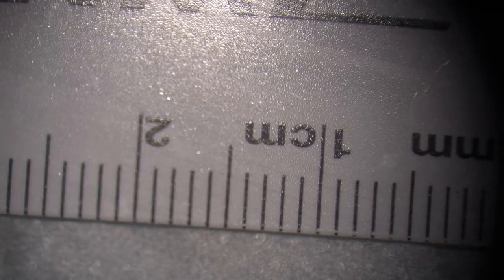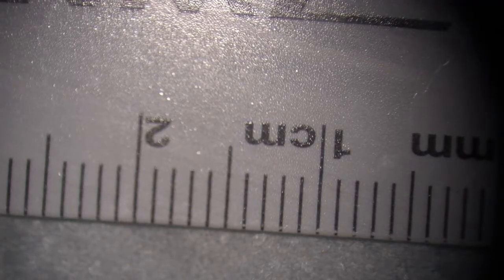We want perfect, not just okay, because if it's only okay, in order to see clearly, the muscles in our eyes need to compensate to make a sharp image to our brain. That's where the fatigue comes from. So you have it as clear as possible. If not, you're going to fatigue more. The eye muscles need to work hard to compensate and make a clear image. So just let the microscope do its job instead of us. We need the perfect imaging.